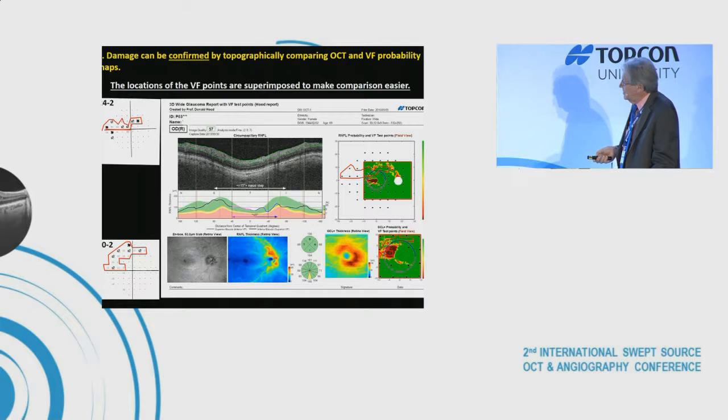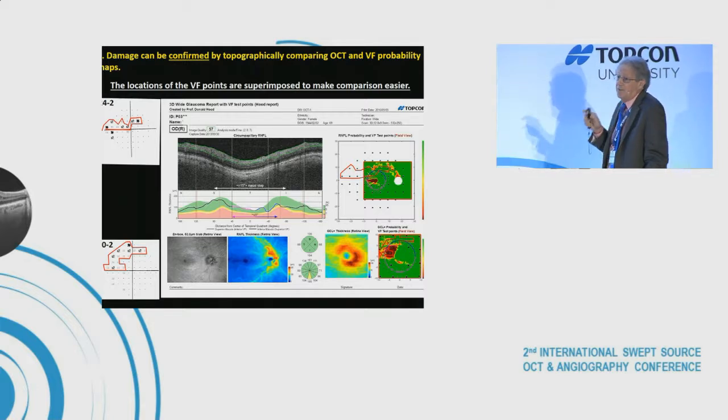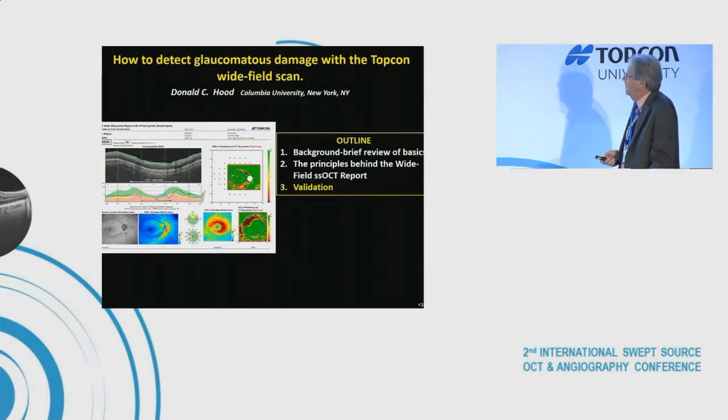If you circle this and circle the 10-2 points, I should have made it clear. On this map here and here, the big points are the physical locations of the 24-2, and the little points are the locations of the 10-2. So when I'm circling these here, I'm circling the corresponding points on here.